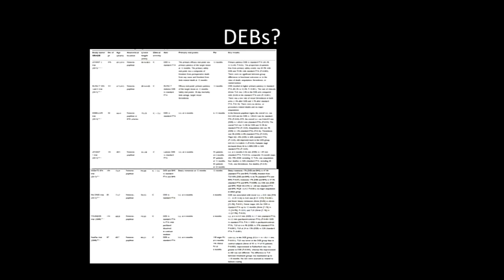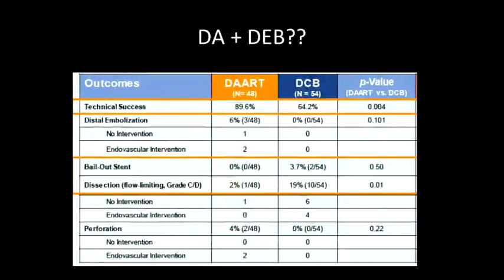This is a situation where the wire has to go through the true lumen. And now you can see that we've got a balloon which is 7 mm by 40. The stent we are using here is 8 mm, an Armada, and we're trying to get the balloon across.